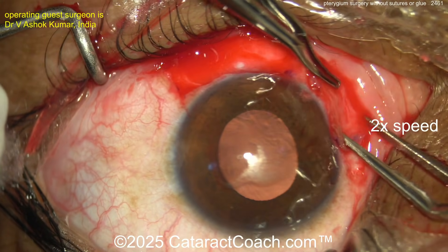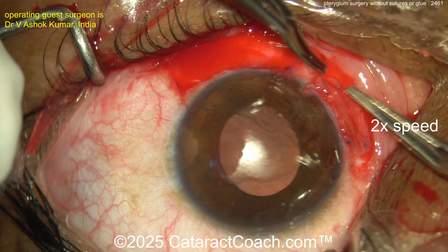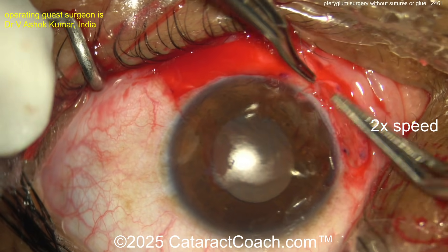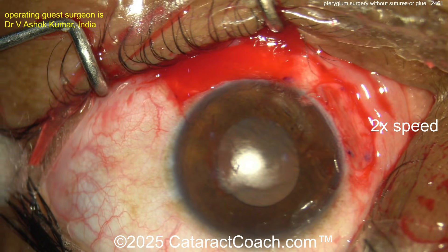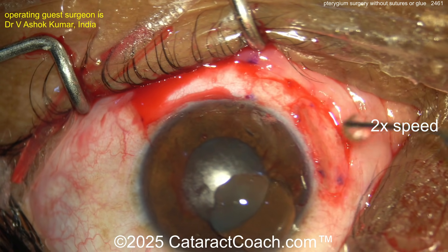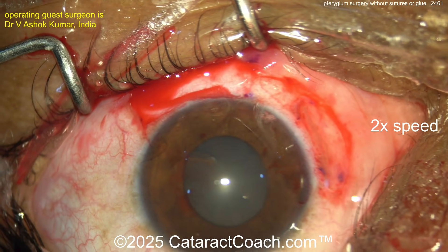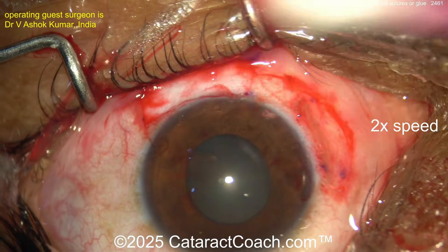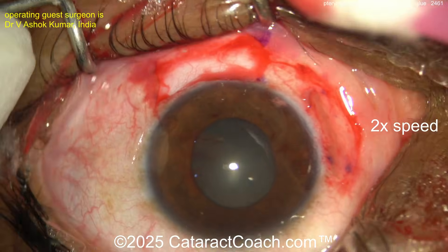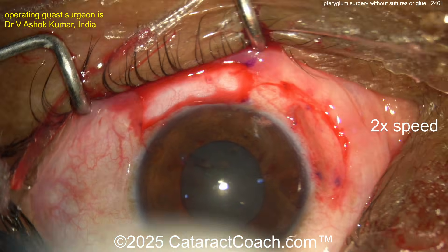What's different in this case is that a corneal-scleral contact lens will be placed to hold the graft in position. Spreading the graft out nice and easy, giving it time for the blood to congeal and clot. That's why you didn't do all that cautery. Being patient — give it time. Just a couple of drops on the cornea to moisten it. The graft is staying in good position, and the surgeon's final trick is that large-diameter corneal-scleral contact lens, left on the eye for at least a few days to hold the graft in place. It's fixed very nicely.